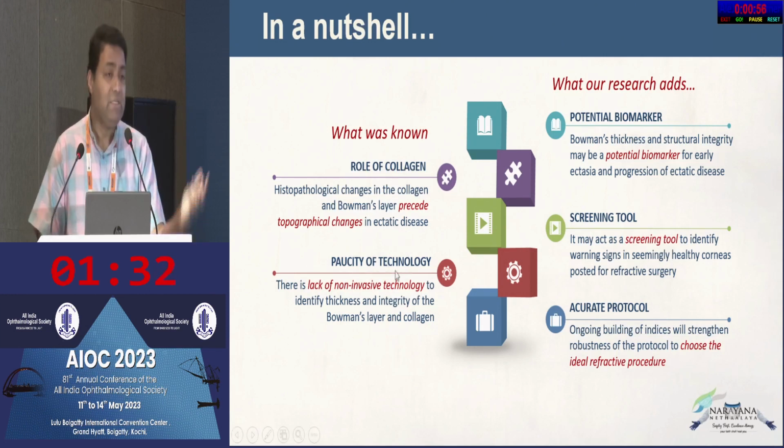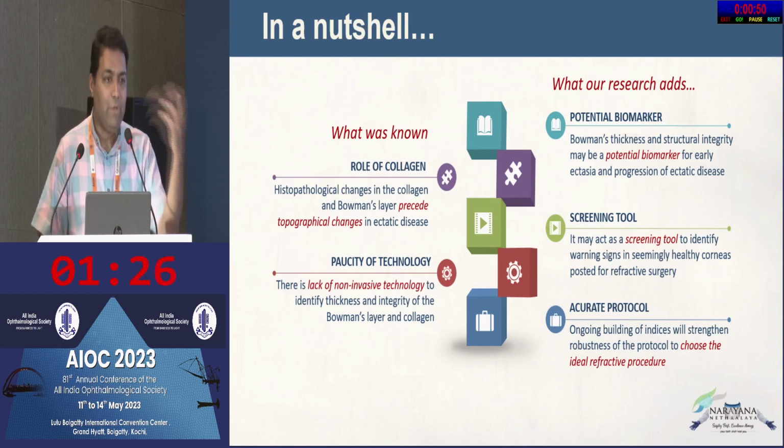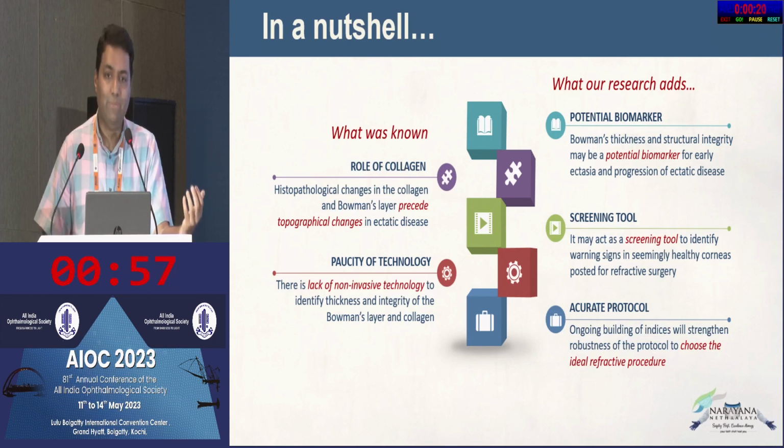And this is a non-invasive technology, and maybe next year the same technology will be able to image the keratocytes, the many cells in your cornea, and every layer would have different patterns to it. And this is a big biomarker, maybe even in planning procedures. Also, sometimes when you have unexpected outcomes, especially in cross-linking, when you get a scar, excessive collagen, if you do a cross-linking on it, you get scarring. This is what we have noticed. And this also can help us to decide when we need to do a LASIK or a SMILE Xtra, or you can just ignore it in spite of corneal topography being abnormal.